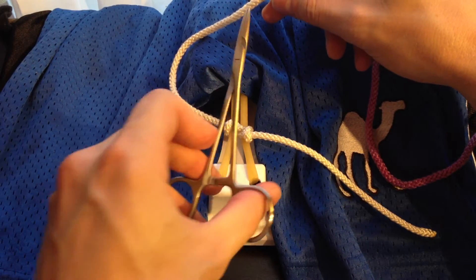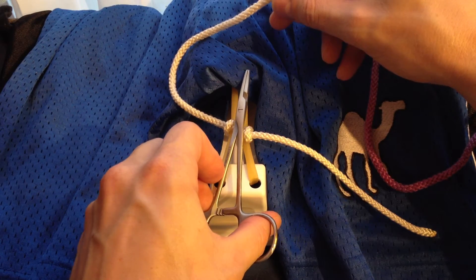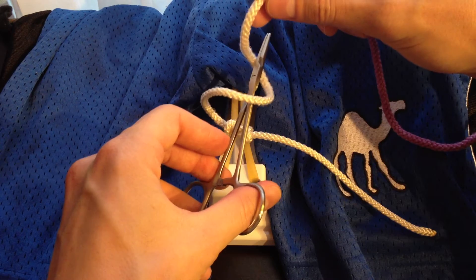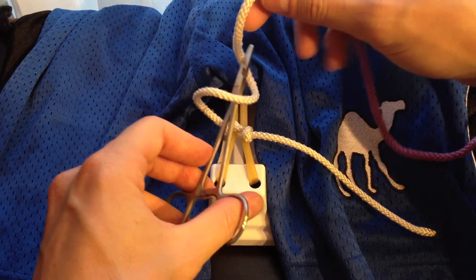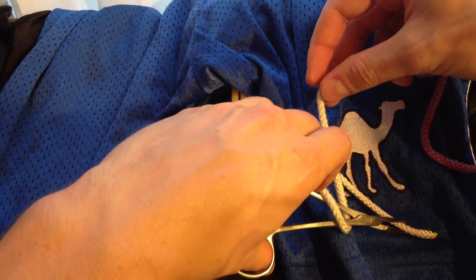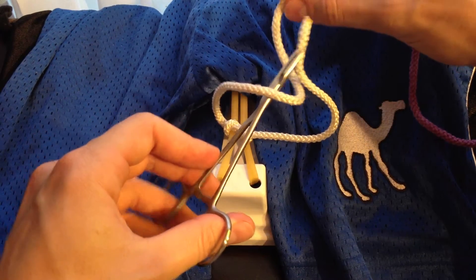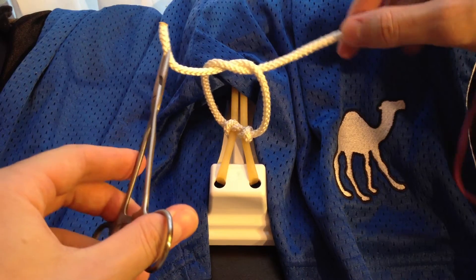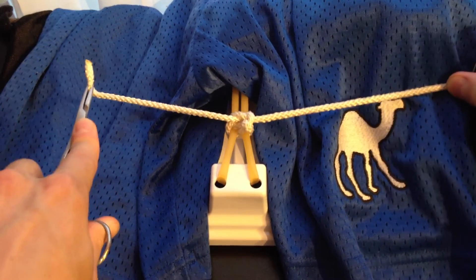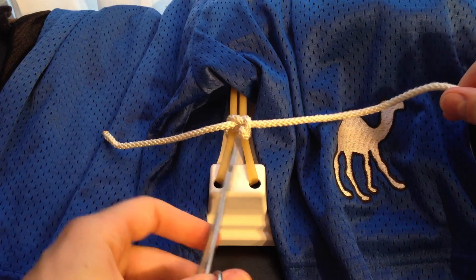To tie the next knot, again, we start with our needle driver right on top of the incision. This time, we're only going to loop once. From here on out, we only use one loop — it's only that first knot where we do the two loops. So we loop it once, same thing, grab it as close to the tip as possible, pull it through, and to tighten it, pull it in the opposite direction. So there we go — we've got our first square knot.